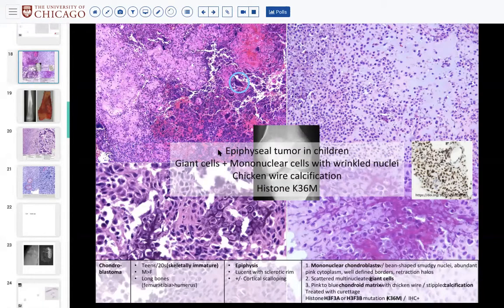So here is what a classic chondroblastoma looks like, where you could imagine that this very fine chicken wire calcification in the background might resemble that osteoid. You certainly should see some kind of cartilaginous elements in a chondroblastoma, which we didn't see in ours. And the nuclei are usually small and round to ovoid and kidney bean shaped, but not hyperchromatic, enlarged, atypical, right? They're very, very monotonous.